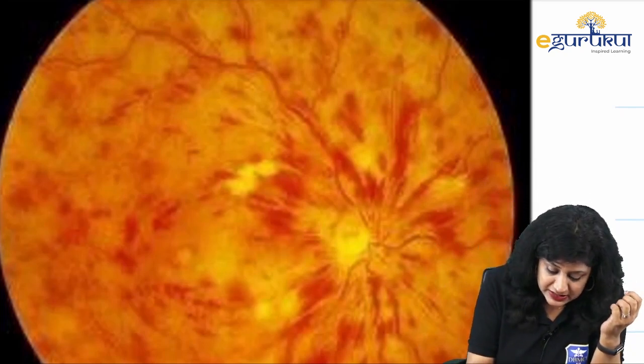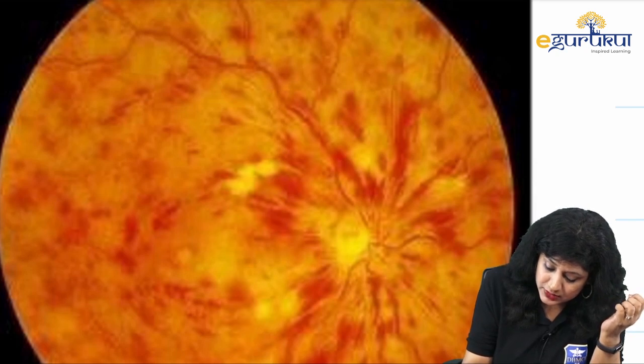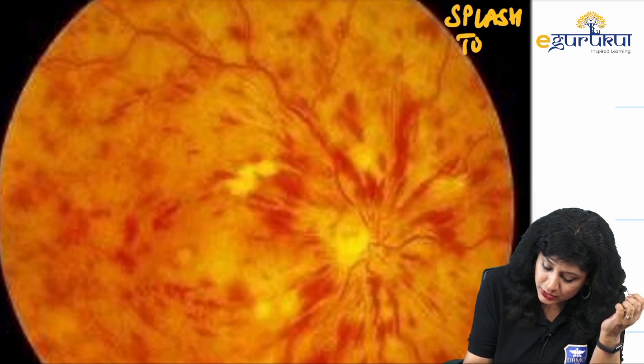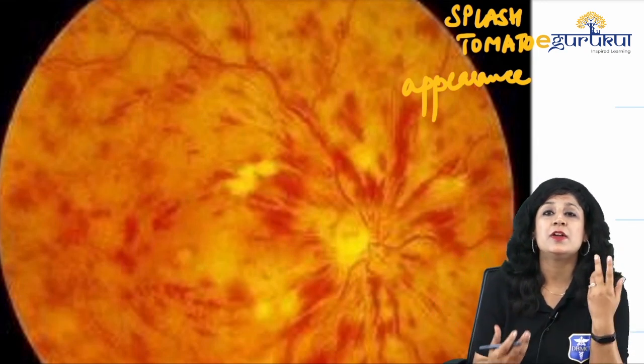So this is typically the splashed tomato appearance. This is a very, very typical splash tomato appearance. It is also called the blood and thunder appearance or the ketchup sauce appearance. And where do you get it?